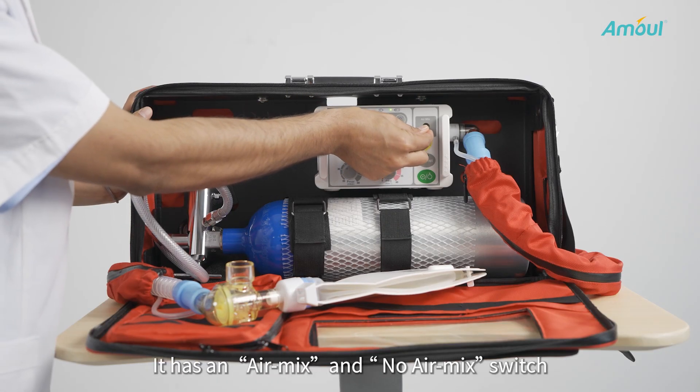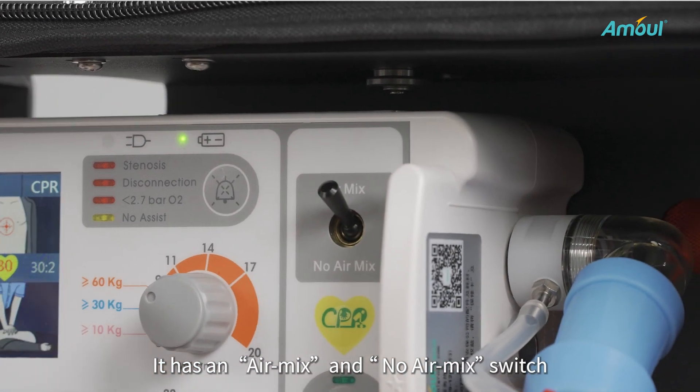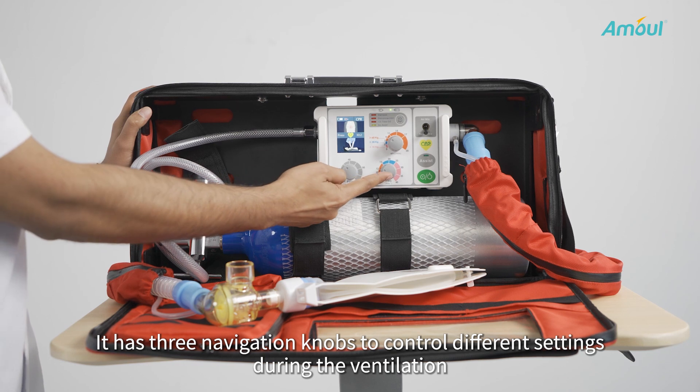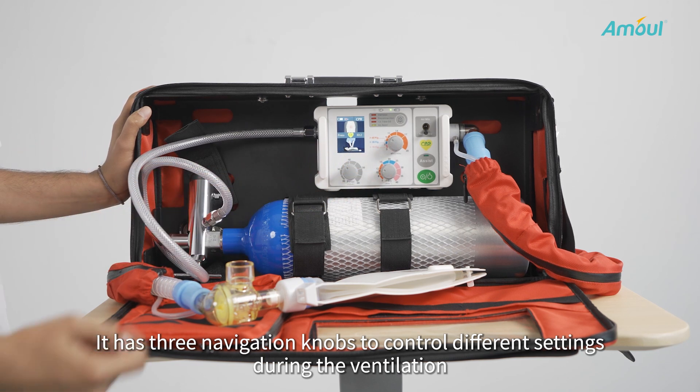It has an air mix and no air mix switch. It also has three navigation knobs in the center to control different settings during ventilation.